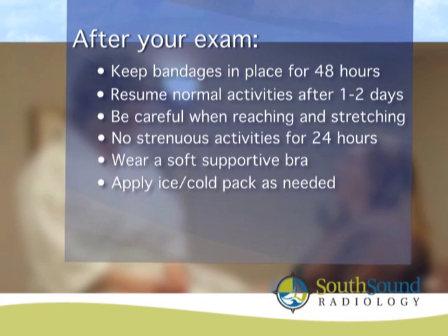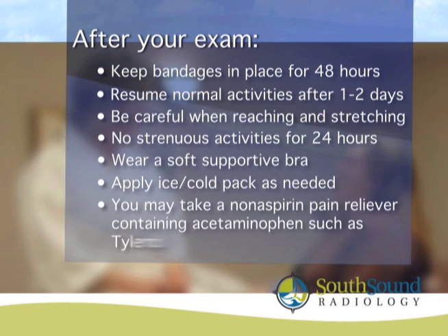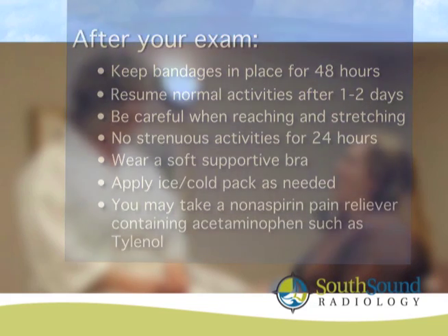To ease bruising and mild discomfort, you may apply a cold pack as needed. If a pain reliever is needed, we ask that you take Tylenol or acetaminophen. Do not take aspirin or ibuprofen products for 48 hours after your procedure. You will also receive a copy of these instructions following the procedure.